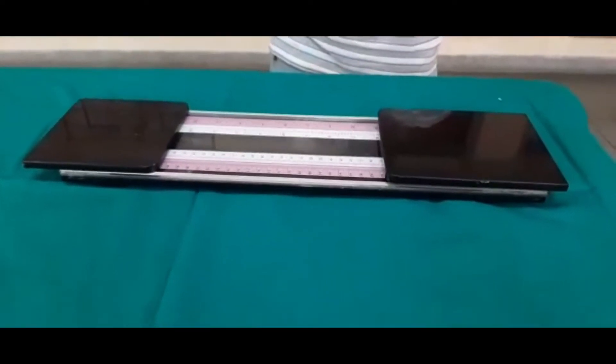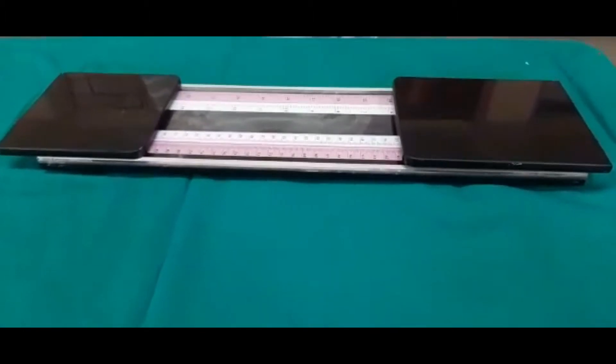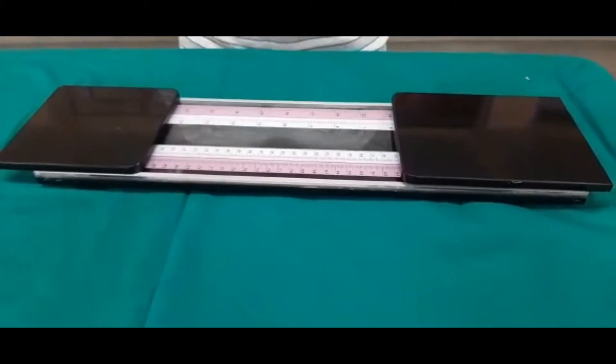Hello students, today we are going to discuss the demonstration of an infantometer and it helps to take the length of the baby.